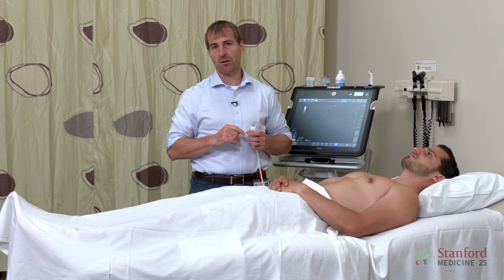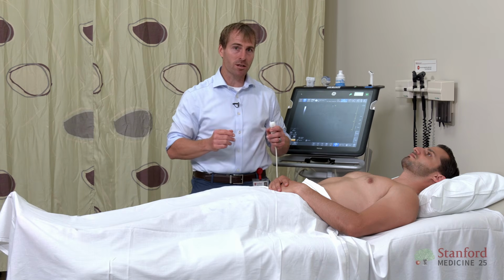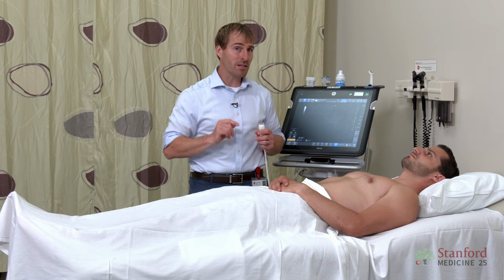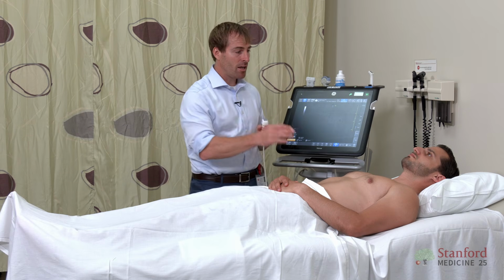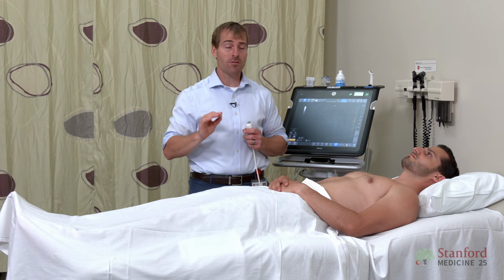That's where the collapsibility comes in. That's why we did that. So we said, okay, his is 2.4 centimeters. That's normal. Now we need to take a look and see how much it collapses. He went ahead and sniffed. We saw he completely collapsed his IVC. Anything greater than 50%, we're going to go ahead and call that normal. Their CVP is almost certainly normal, and you're done, okay?